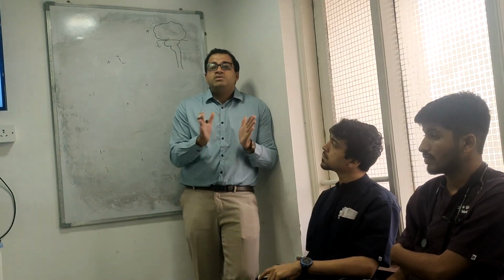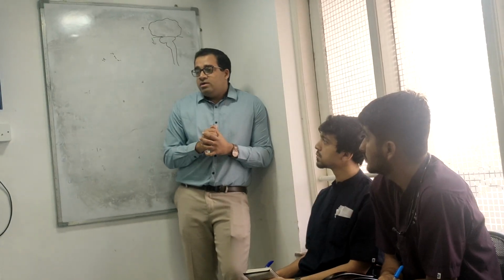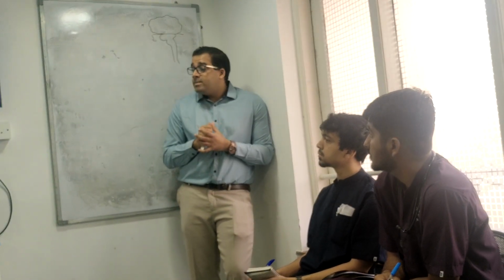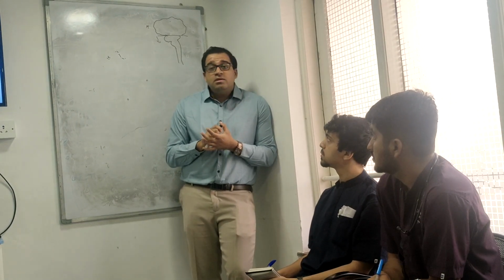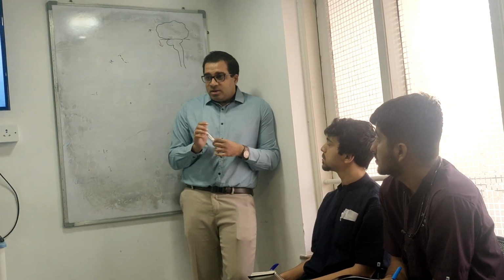See, basically the seriousness of a culture report. Now I'll start with which of these can be a contaminant. So the 7th is a Candida albicans. Out of these, what can be a contaminant? What is not a contaminant? Candida can be a contaminant, no? Sorry. Staph hemolyticus is a coagulase negative staph. Most likely it will be a contaminant.